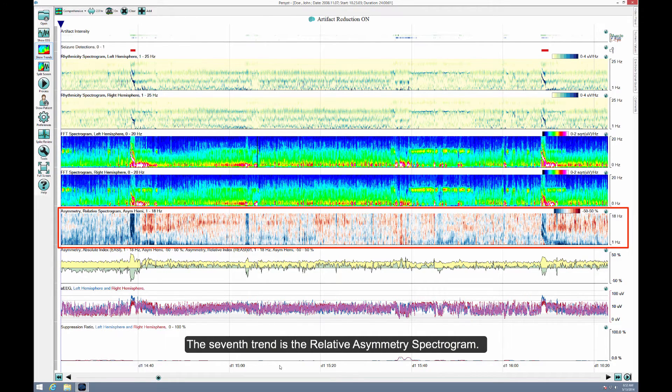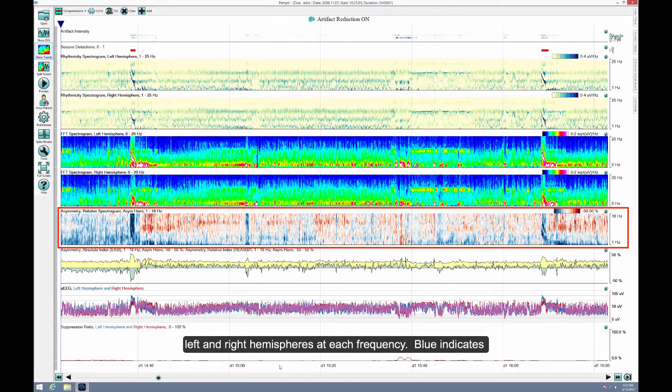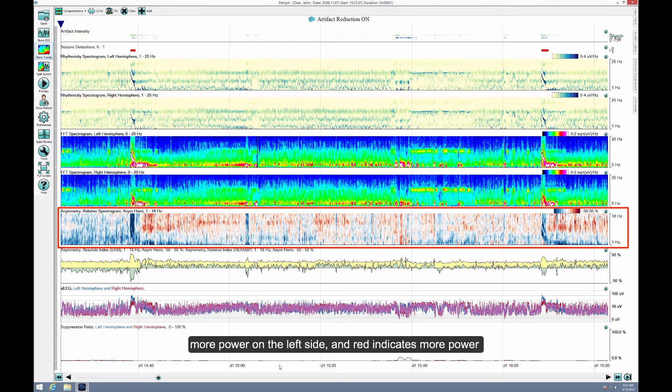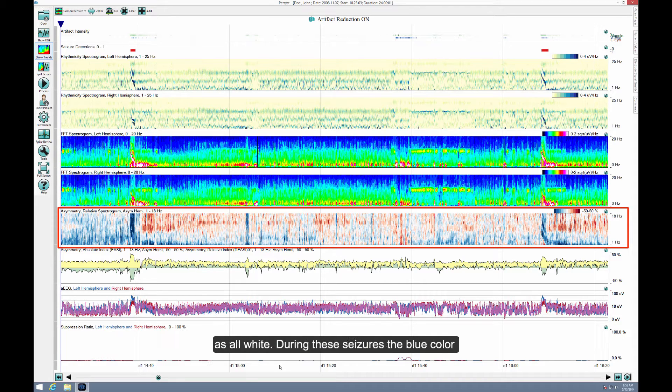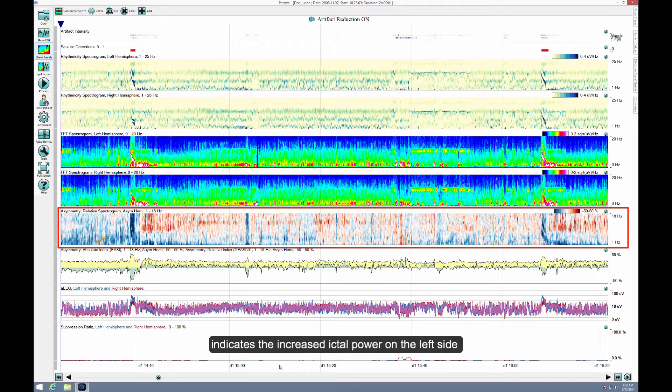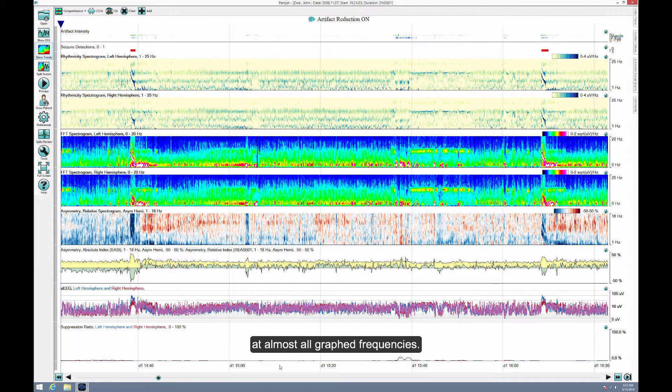The seventh trend is the Relative Asymmetry Spectrogram. This compares the power in homologous electrodes from the left and right hemispheres at each frequency. Blue indicates more power on the left side, and red indicates more power on the right side. Perfect symmetry would display as all white. During these seizures, the blue color indicates the increased ictal power on the left side at almost all frequencies.